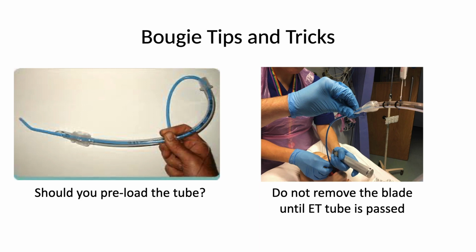And the other thing that I see that we commonly make a mistake is you feel like once you're through the cords, your job is done, and it's really tempting to remove this blade. Don't do that because it's still holding all of those very heavy, very bulky soft tissues off the back of the throat. And so keep the blade in place, keep lifting with your left hand, and have someone else thread that tube for you. Please leave the blade in the mouth because it will make your job easier because you still haven't passed the tube through the cords yet.